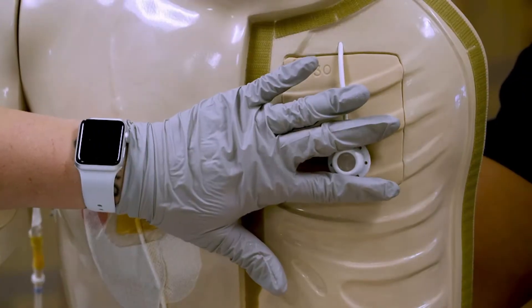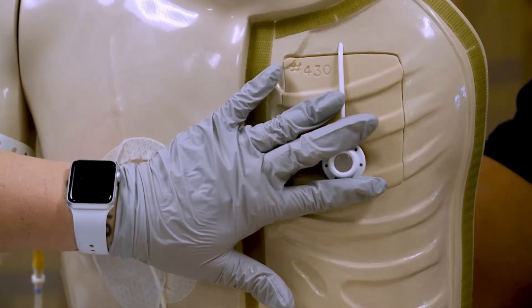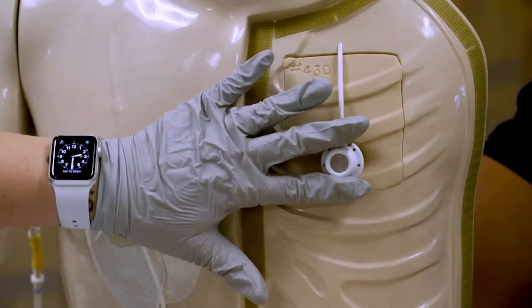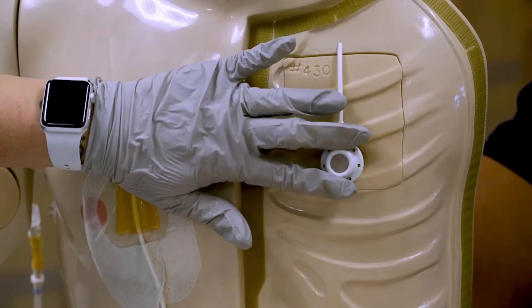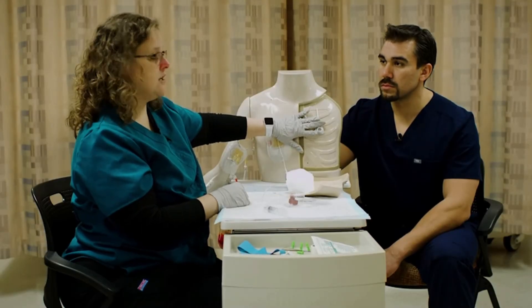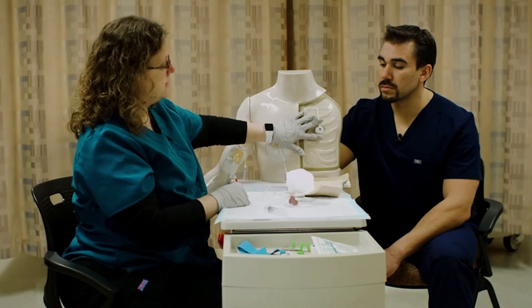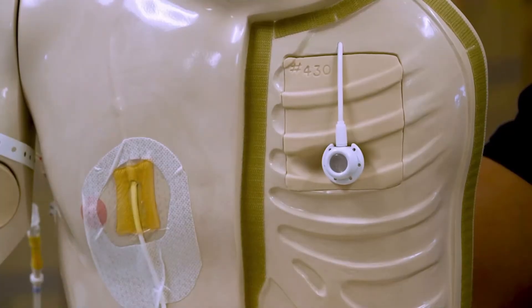So I feel under the patient's skin that this is sticking up, so it lays under that subcutaneous layer. I can feel that this is sticking up through the patient's skin, so I'm going to feel around and make sure what kind of device I have. Sometimes they're in a triangle, sometimes there are two side-by-side, and each one of those means something slightly different. But I just have one.